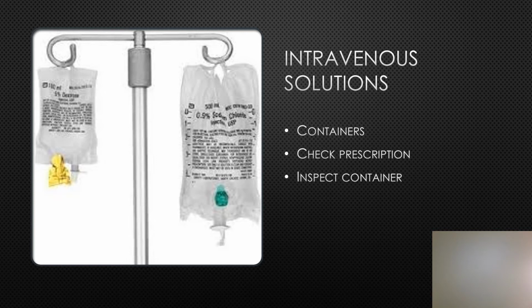Never use a marker directly on the bag as the chemical can penetrate and bleed into the solution, contaminating it. Always use a label that contains information per the facility's policy. This is usually the client's name, their room number, any medications added, their identification number, the date and time hung, and the flow rate. A solution container should never hang more than 24 hours because of the risk of bacterial growth. Containers come in a variety of sizes, from 25 mLs to 1,000 mLs being the most common.